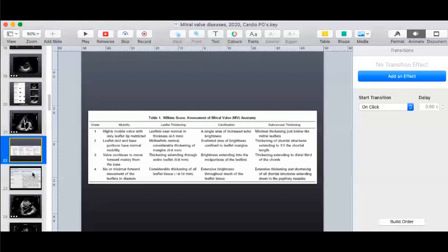Now, what is the limitation of the Wilkins score? This is another question that is asked. Commissural calcification is not included. Right. Then? LA thrombus. LA thrombus, right. Mitral regurgitation. So be aware of these queries that will come to you as to why the Wilkins score is not an ideal score, and what has happened over the last few years in terms of making it a better score. What new approach has there been now?